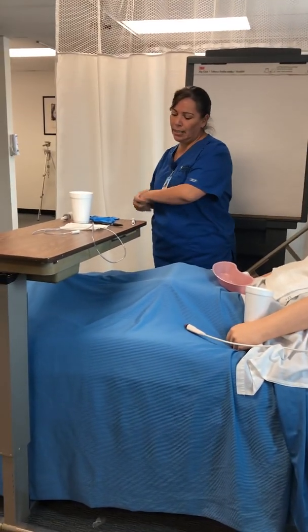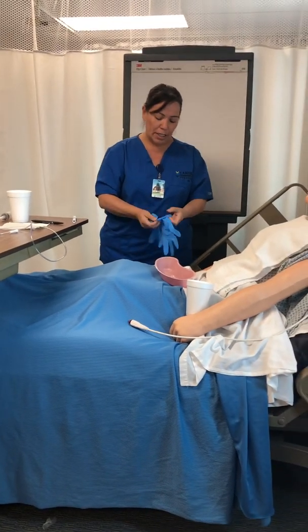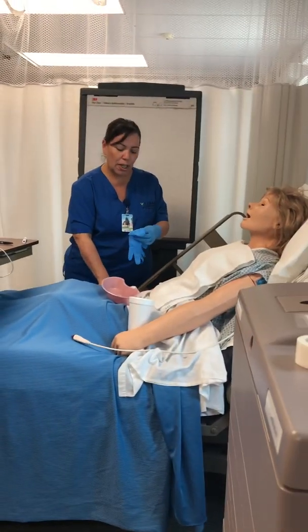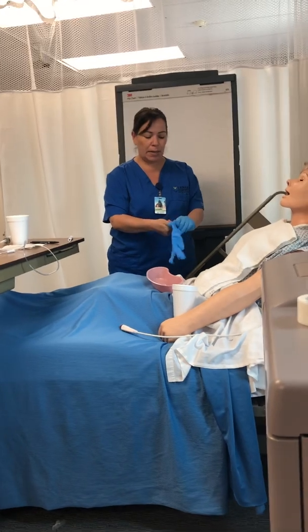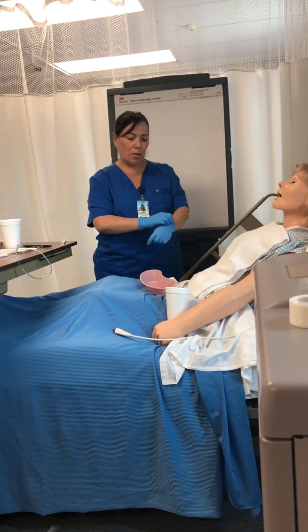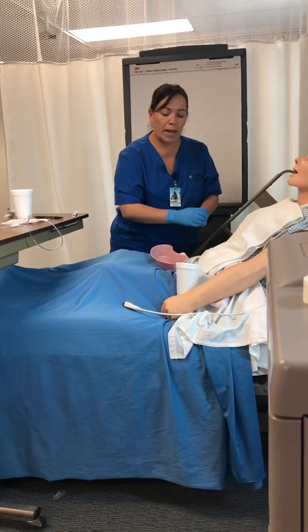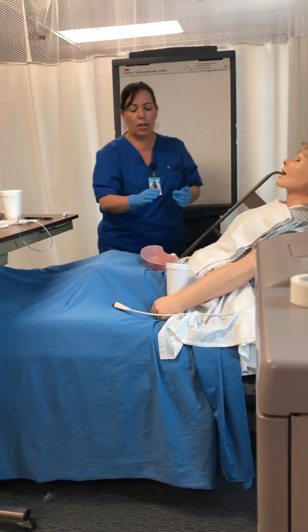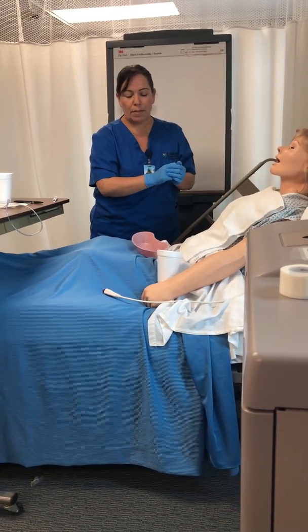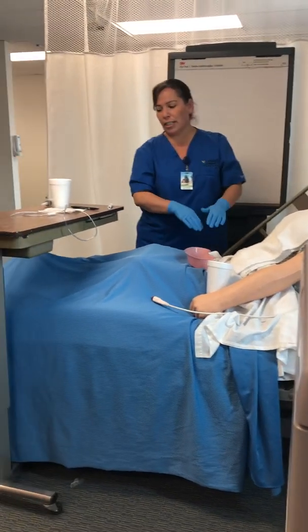I'm gonna wash my hands, put on my gloves, and do my 2 patient identifiers, and I'm gonna pull the pulse ox to check for pulse and to check the stability of the patient. So I have a towel on top of his chest or her chest. I already provided some water so he can swallow when we're advancing with the tube. And I have a basin within reach just in case.